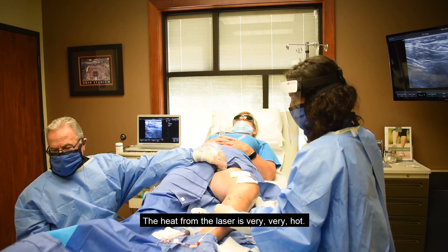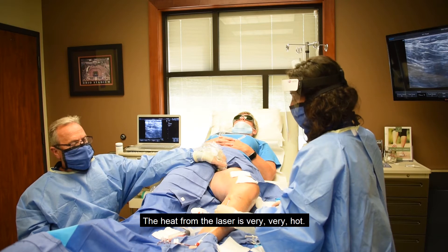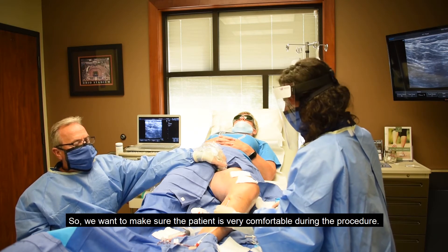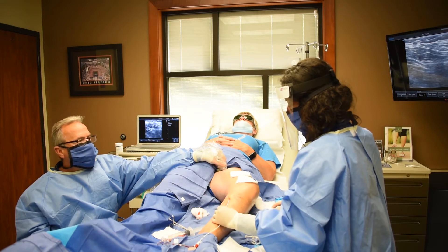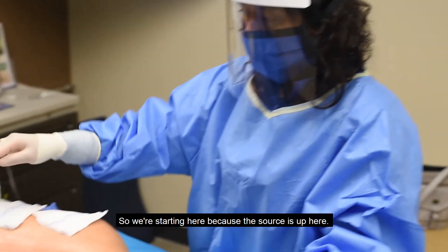The heat from the laser is very, very hot, so we want to make sure the patient is really comfortable during the procedure. We're starting here because the source of the problem is up here and the blood flows back down.